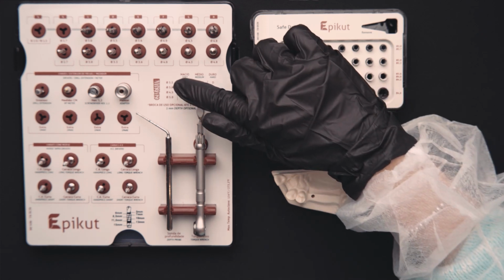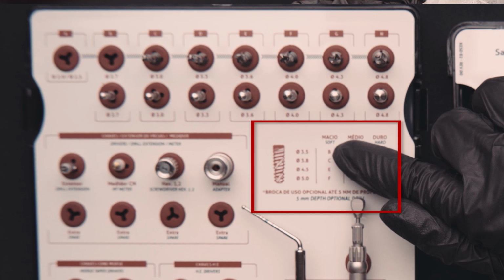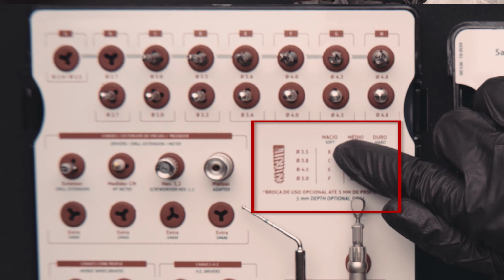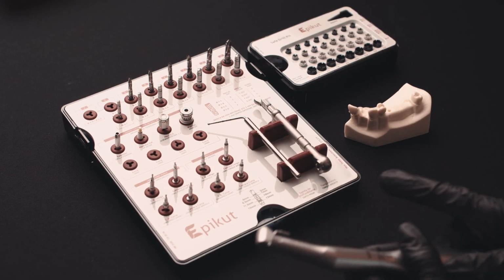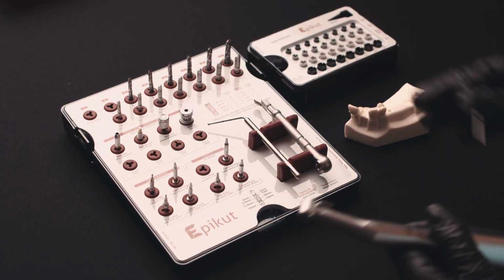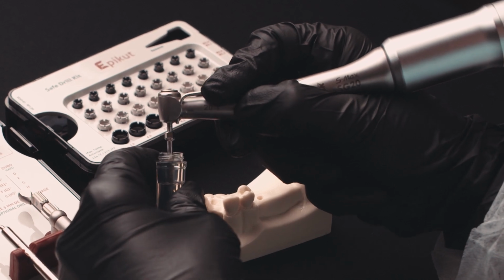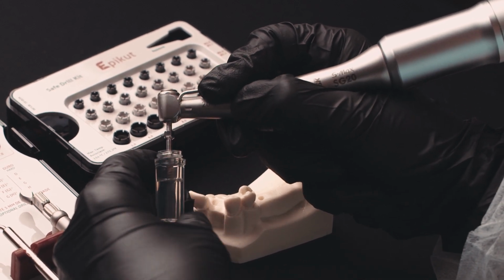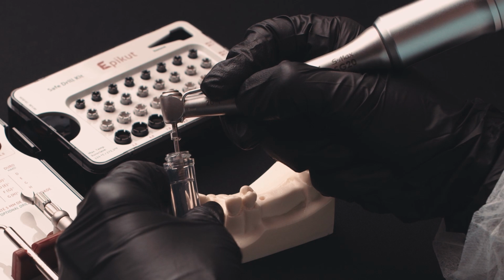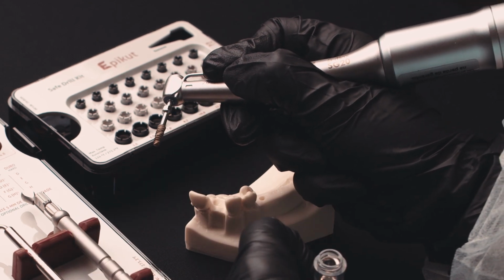As it is a 3.5 mm implant in soft bone, we finish with the drill B. For this reason, we can now take the implant installation driver for handpiece. Press the handpiece driver against the implant blister and rotate it so that the driver captures the implant.